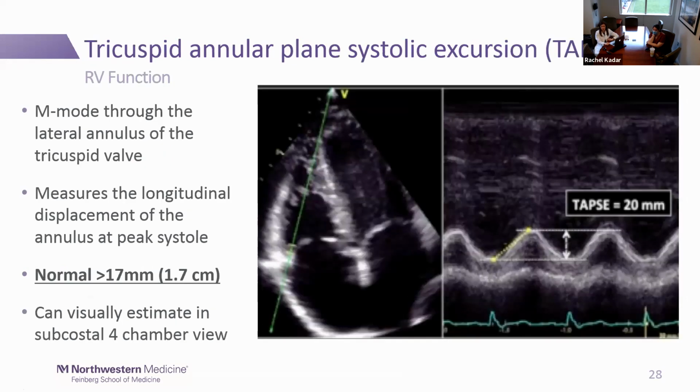The last right ventricular assessment we'll talk about is TAPSE, or tricuspid annular plane systolic excursion. This is great to learn about RV function. Again, this is essentially just the opposite of MAPSE. Although MAPSE is more of a POCUS view that you just qualify by looking with your eyes. You don't necessarily measure it, and it's not something that's in the echo reports. It's something that's more of a POCUS thing. Whereas TAPSE is used by cardiologists, it is in the echo reports.